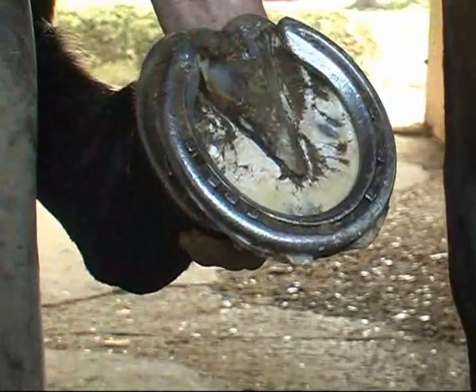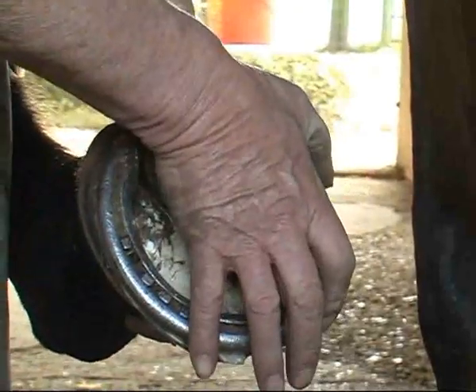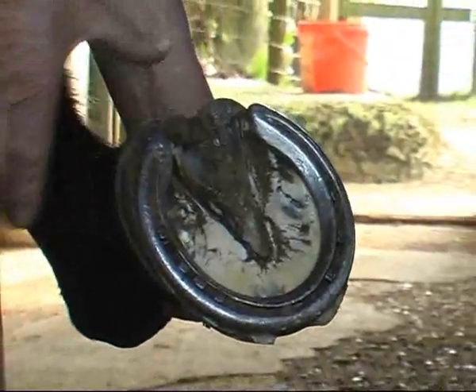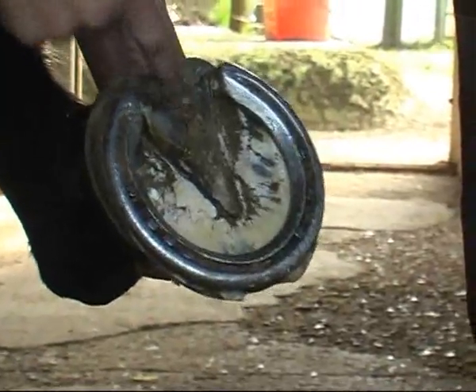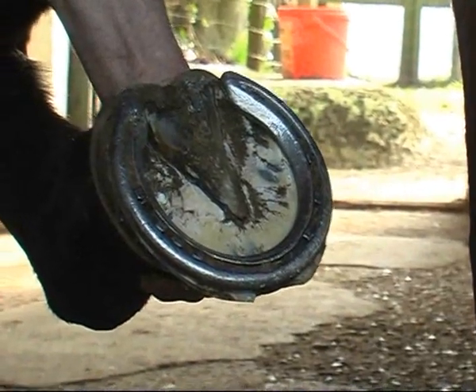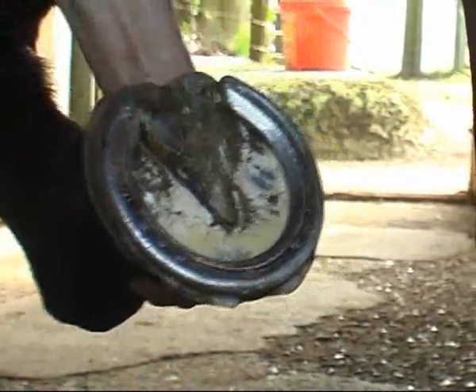When I just put the shoe back on, this part of the foot — the shoe was the same shape as before — yet I had to swing the heels on a bit because the heel has got much more stable. It's not wobbling about all over the place. The frog has joined up and we've got a much tighter, more compact unit in the area of the heels.